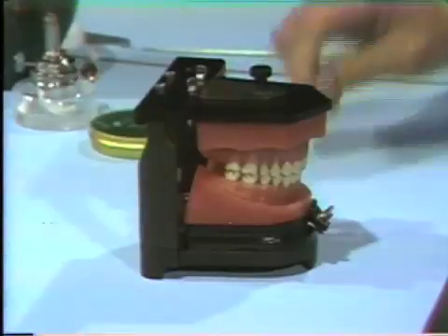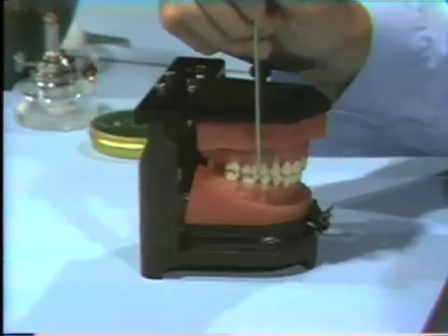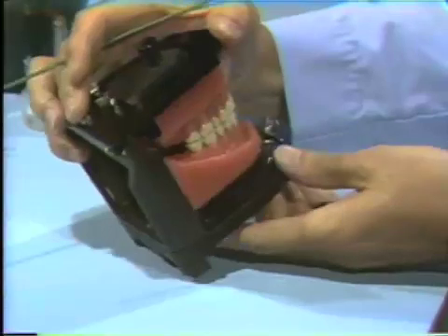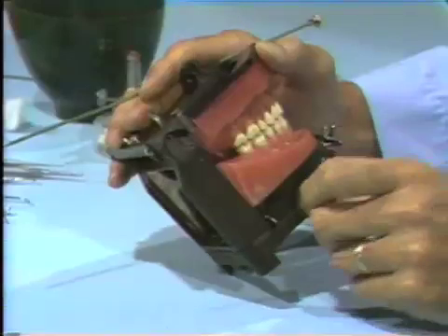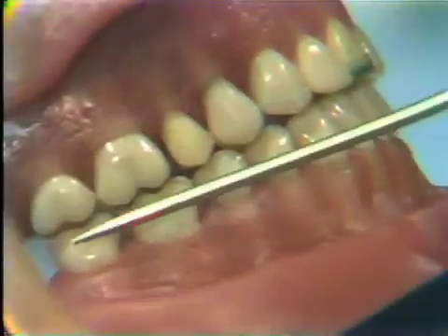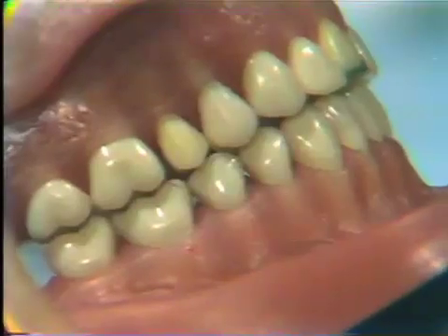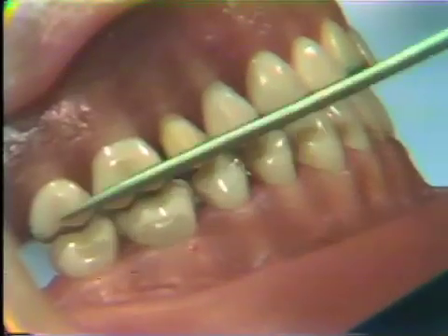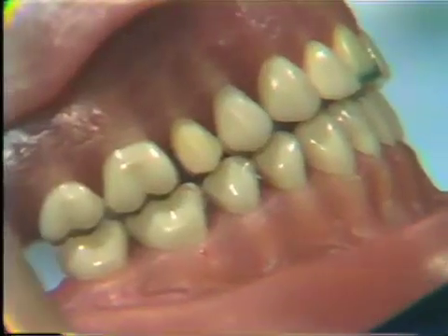The next tooth we're going to wax is the upper right second bicuspid. Before we open the typodont, notice we've placed the prepared tooth in the typodont — make sure it is firmly seated. As a guide, we look at the cusp lengths of the teeth on each side. We want to produce a buccal cusp on this tooth that blends in and is approximately the same length as the buccal cusp of the bicuspid and the molar.